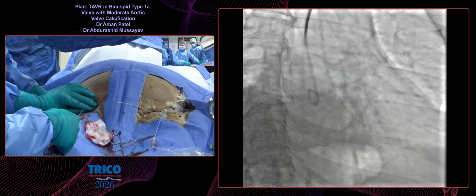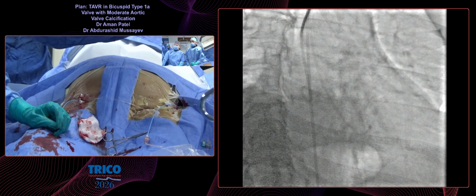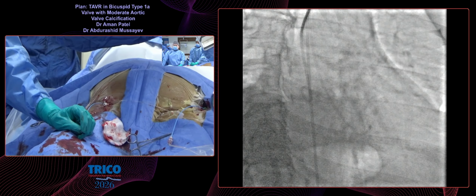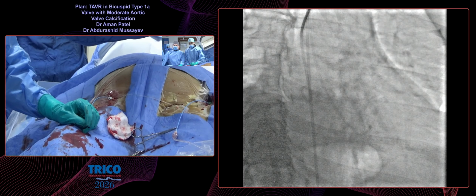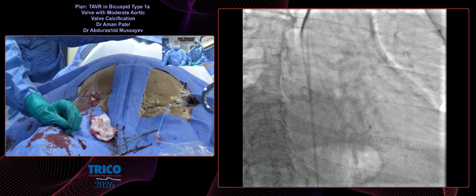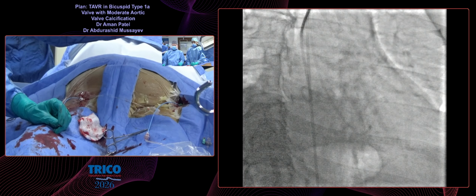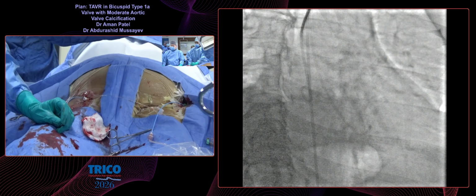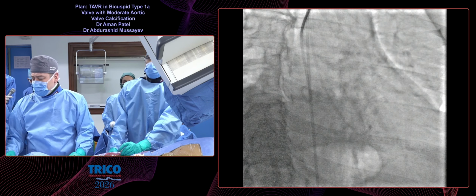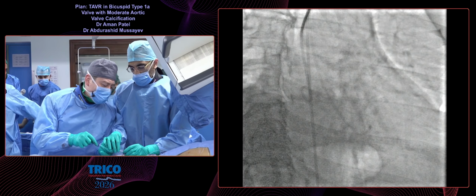What are your preferences? We could save much time with the Lima catheter, because when we cross with it, we could measure the pressure through this catheter, and also we could go directly with a stiff wire. It is not necessary to change to a pigtail or J catheter; it is very safe to go through the Lima catheter with a stiff wire. Only in certain patients with dilated roots and bicuspid valves, sometimes we require an AL catheter.